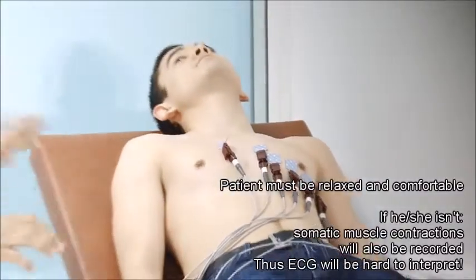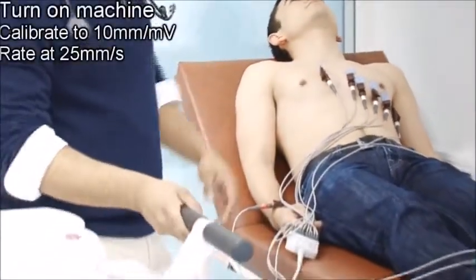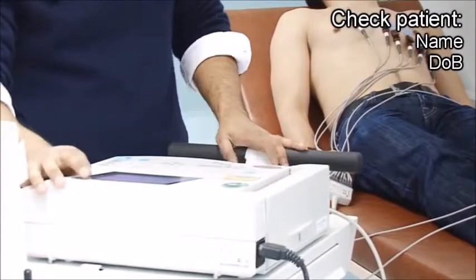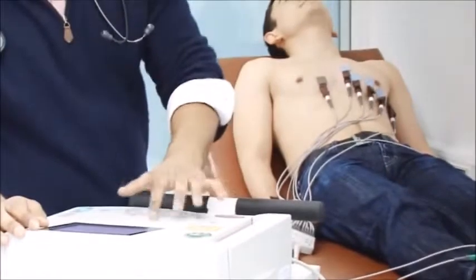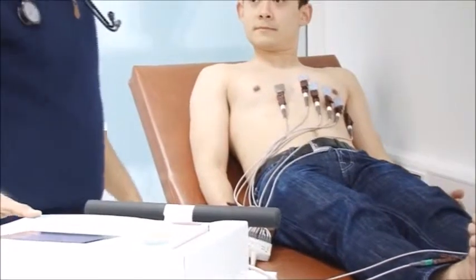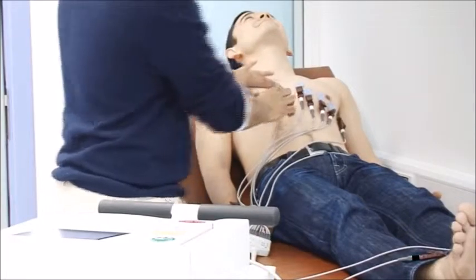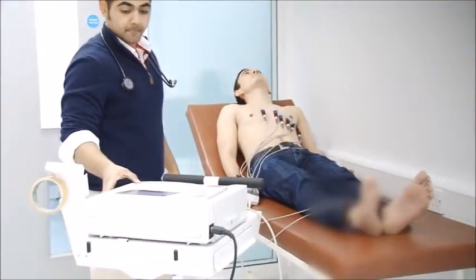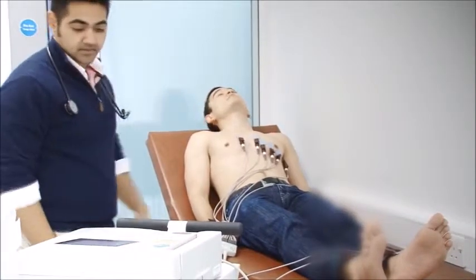So at this moment, if you could just stay very still, I'm going to put in the correct figures into the machine. And can you just quickly confirm your full name and date of birth, please, so I can type it into the machine? That's Tristan Brown, 26th of August, 1990. That's great. Okay, and if you could just stay still. Okay, so sorry about that. So just make sure it's back on again. Okay, so just stay still for me. So just give it a moment while the machine reads out the readings.